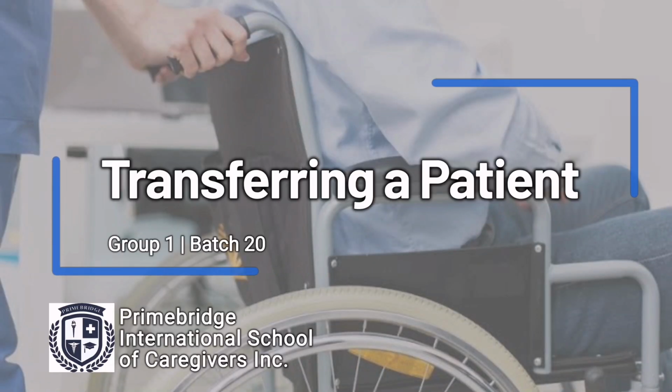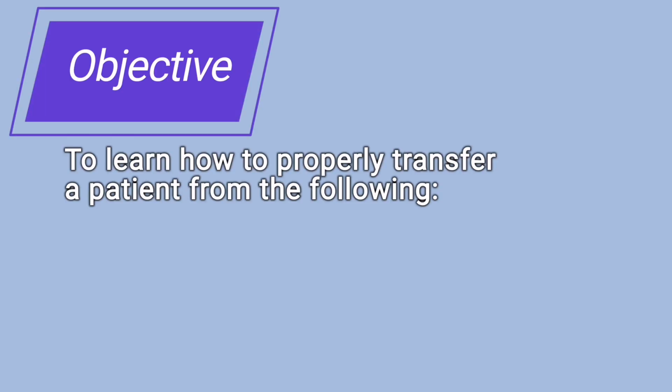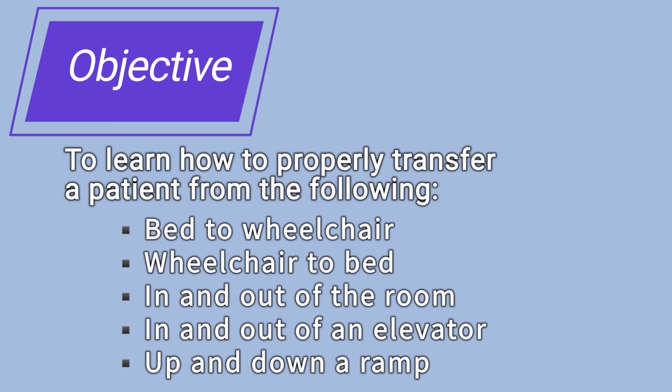Transferring a patient. Objective: to learn how to properly transfer a patient from the following: bed to wheelchair, wheelchair to bed, in and out of the room, in and out of an elevator, up and down a ramp.